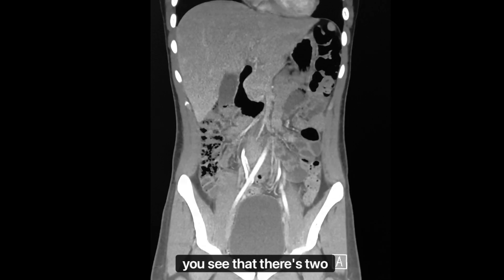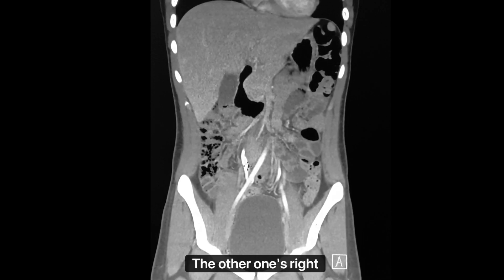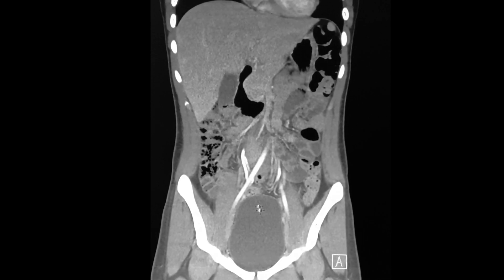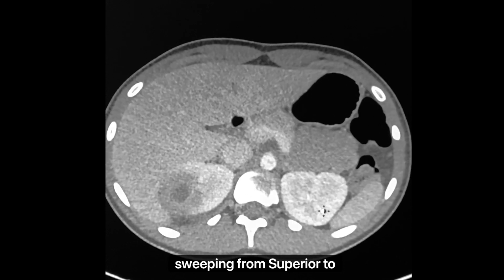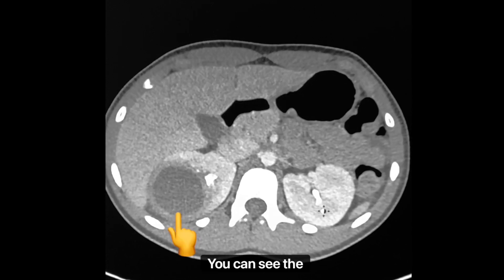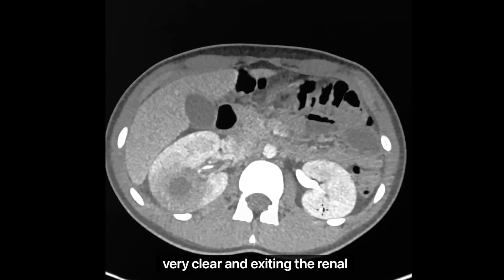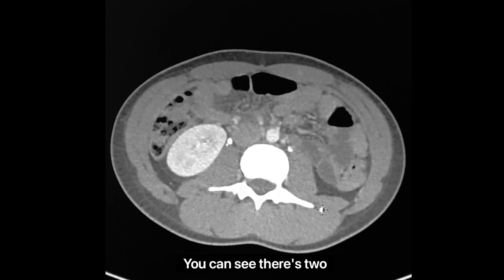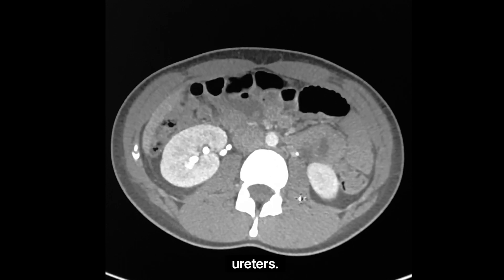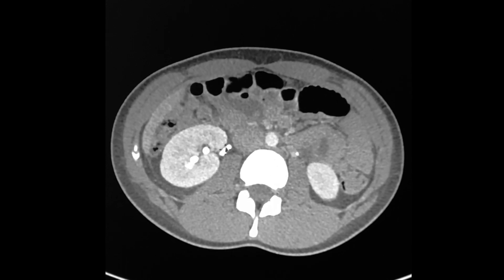You can see that there are two ureters — one ureter there, the other one right there. Here's an axial view sweeping from superior to inferior. You can see the cystic lesion again, very clear. Exiting the renal pelvis, you can see there are two ureters. So this is a duplex right kidney.